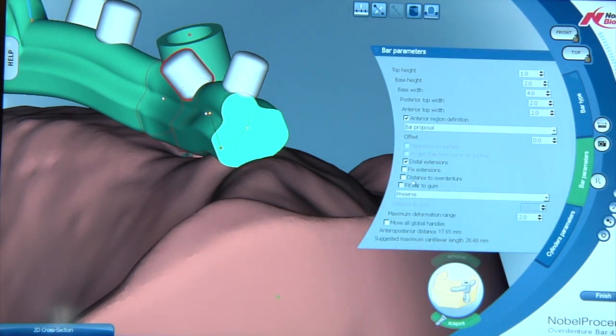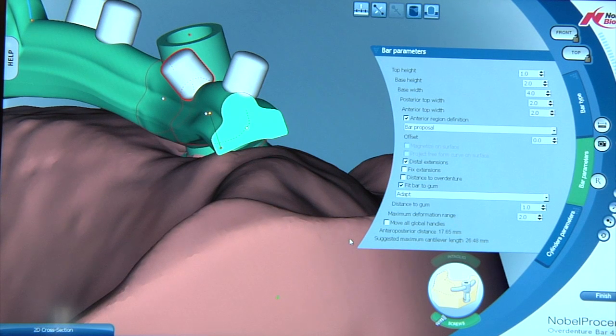Down at the bottom, you have a fit to gum feature in here. So what it does is it takes the bar and fits it directly to the soft tissue. If we change this to fit bar to gum feature and activate the feature, notice what happens. The bar will contour itself to the ridge and if we want to adjust how far off the ridge we are, we have a distance to gum here.